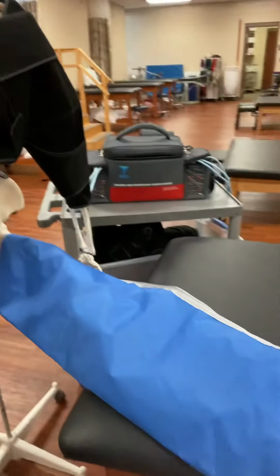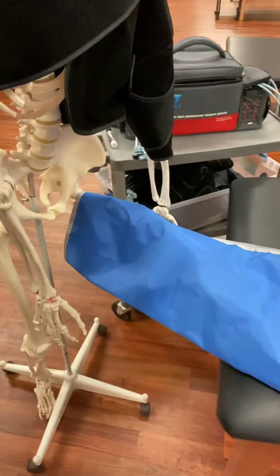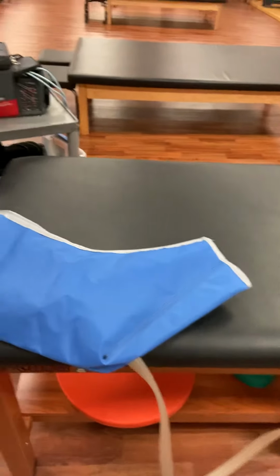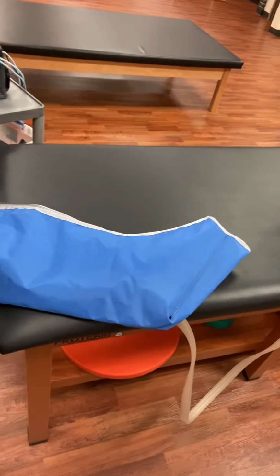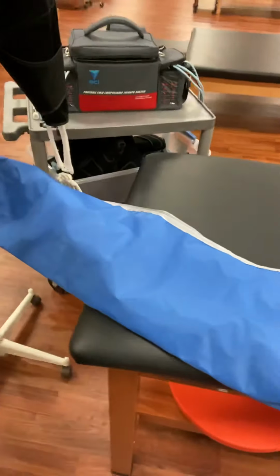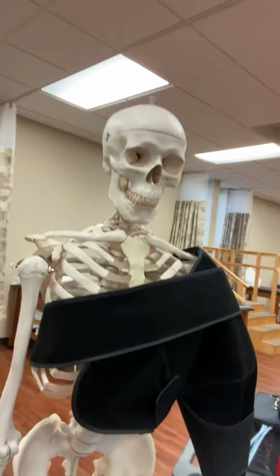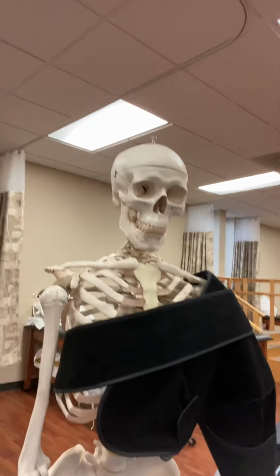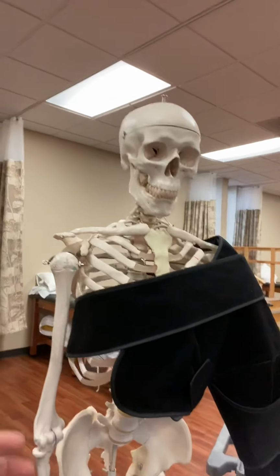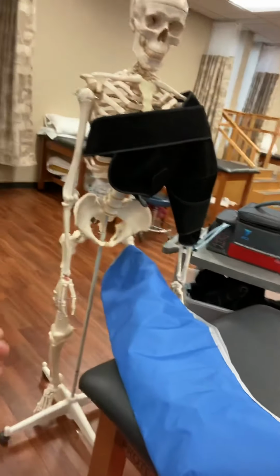But we also have one going on the lower extremity, and this is a monster of a cuff. Look at that. That goes from Tony's toes to Tony's ischial tuberosity. So we are talking about some major lower extremity compression going on here. Now, some things to know. If we're looking at an upper extremity issue, we're only going to make our settings at a 40 to 60 millimeters of mercury pressure gradient. And if we're looking at our lower extremity, well, we can kick that up to 60 to 80.